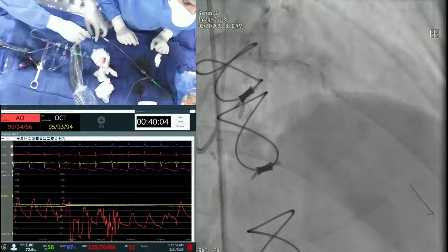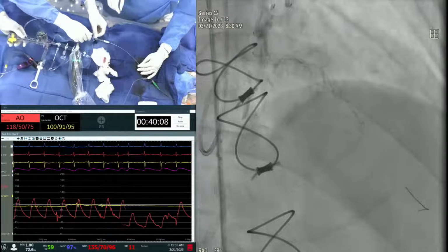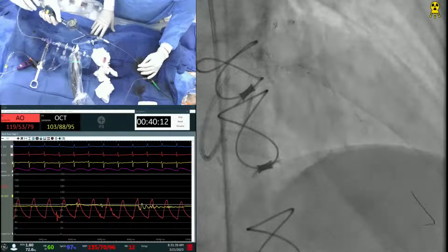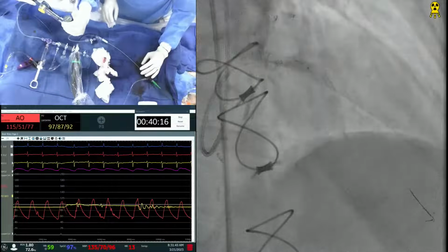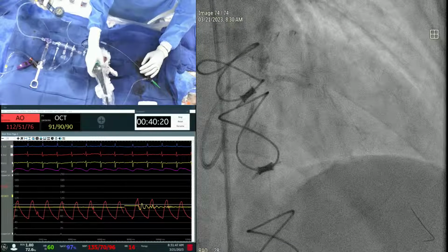Go. So this 3.5 has crossed it. Okay, go up. Okay, good. 4. You hold it. Yeah, good. No, let him do it. Okay, hold on. One person do one thing. Yeah. Ready. Going.